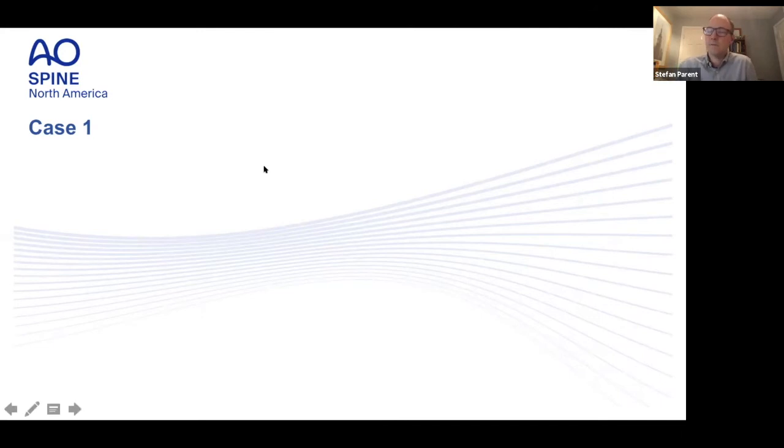Yeah, it's very similar. I go regularly down to L1 through the scope, through the chest. I take the diaphragm and lift it up. I use either a peanut or some retractor to lift up that diaphragm, and I get under. The harmonic scalpel that I use has two prongs, and I use the one that's not active to lift up the diaphragm, and I go under with the live part, and I'm able to get to the segmental. So that's one way of doing it.